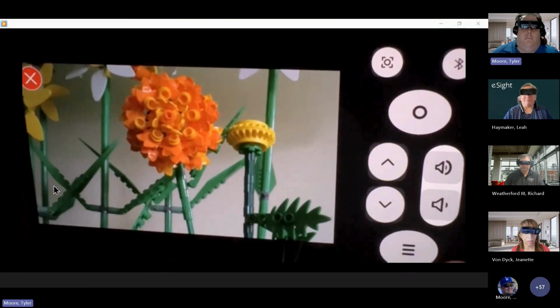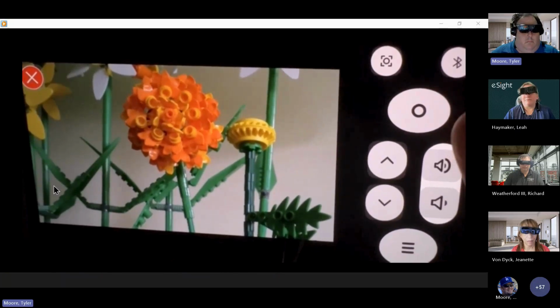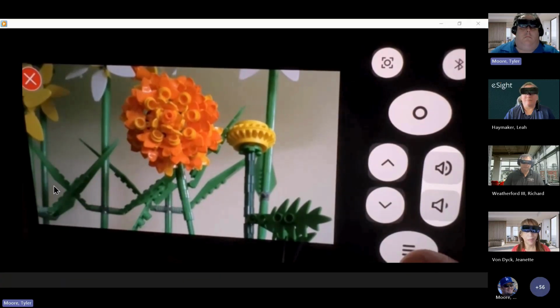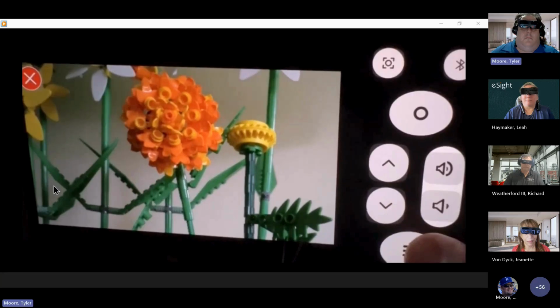There you go. And this all works the same way with the arm controls. With the arm controls on the top of the right arm, your mode button is the front one closest to the hinge. Your menu button is the back one that's going to be closest to your ear. And then you have the rocker bar with the 2 arrows.